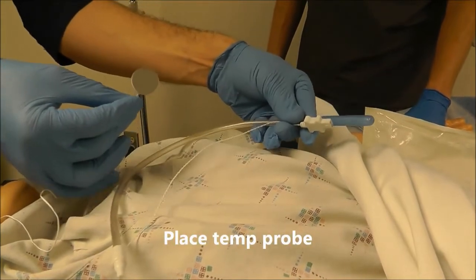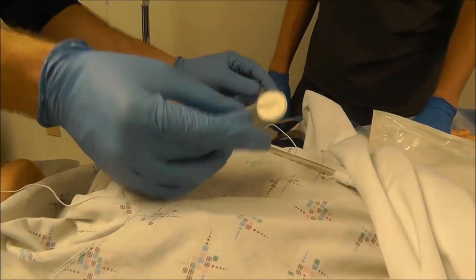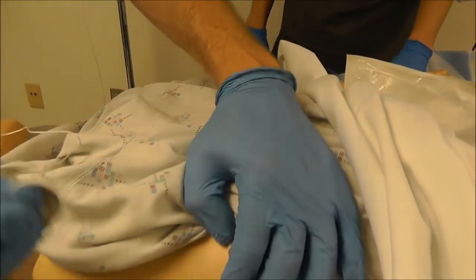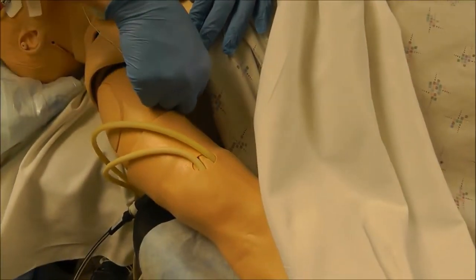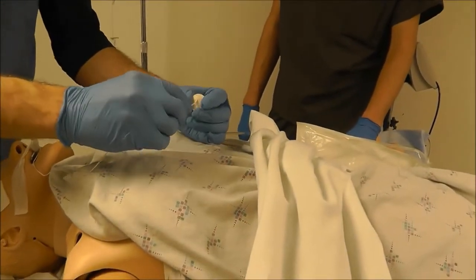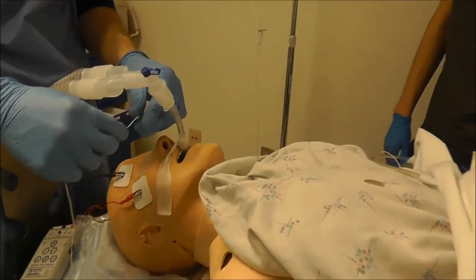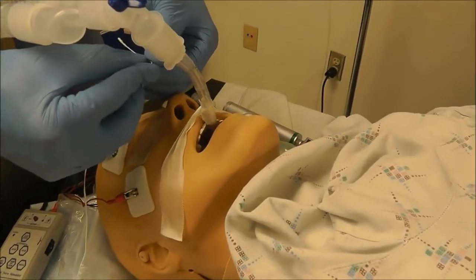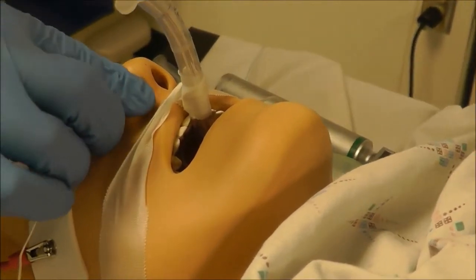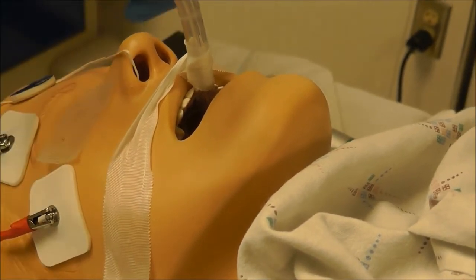We can use an esophageal temperature probe, or we can use a skin temperature probe like this. So how this works is this temperature probe, go ahead and zoom back here. This temperature probe is designed to go in the axillary region. We can actually use it as a nasal temperature probe by just disconnecting here. And then coming over here to the nose, kind of make a little 7 or a little L like that, and go ahead and place it in. And then we can use this sticker up here to secure it into place.